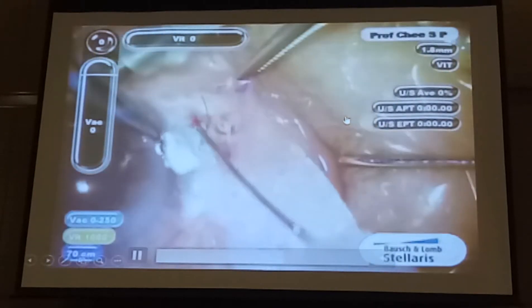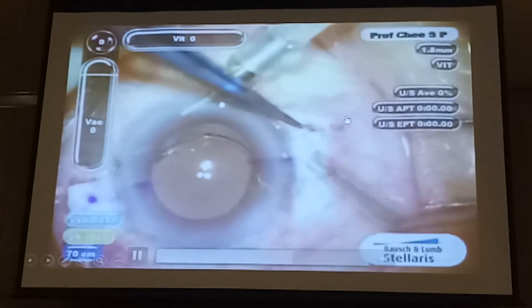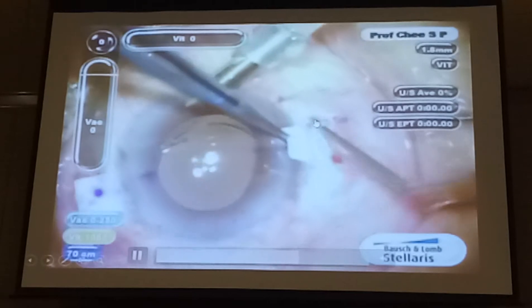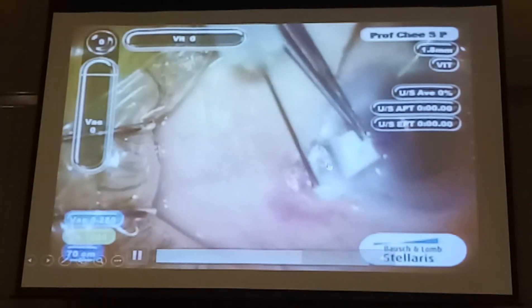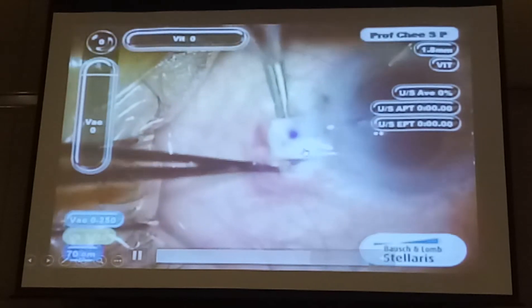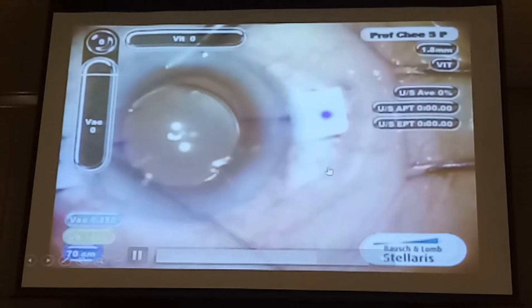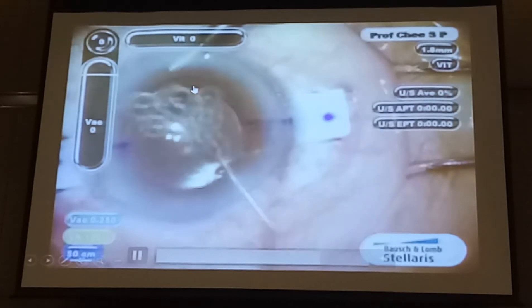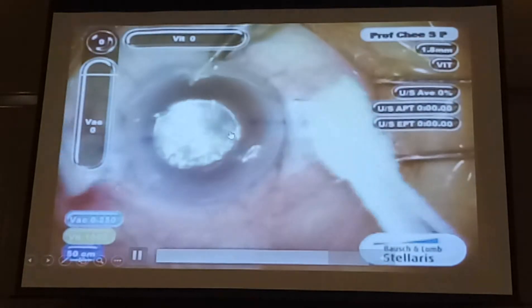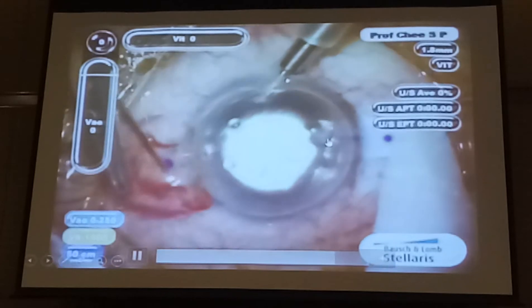When you start, you might want to just mark your needle. This is a 26-gauge needle, so it will be easier to use. We'll just mark the track so that you can find the hole you've created for it to go into the tunnel. You don't want to crimp the tip, because once you crimp the tip it will not be threaded nicely into the tunnel. Whether or not you're IOL-centered depends on these two fixation points — whether you respect them. Whatever you do at this point, you cannot adjust the centration.